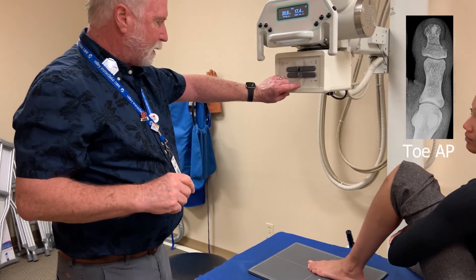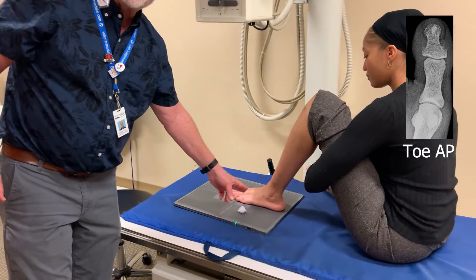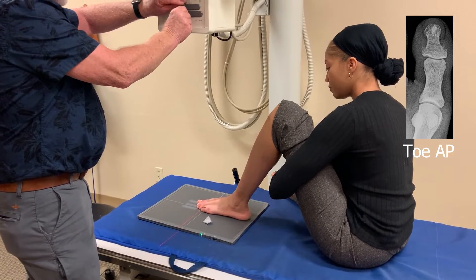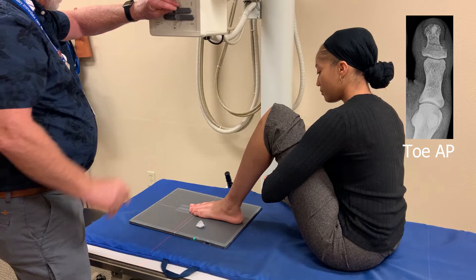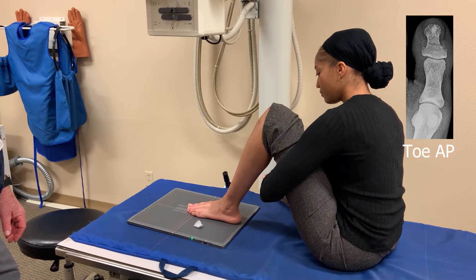AP is pretty straightforward. We typically don't angle like we do on a foot because we're not interested in the joint spaces up in the tarsal area. We're just interested in the interphalangeal joint spaces of the toe, and we center on the affected toe. In this case, we're centering on the second toe there next to the great toe. So that's our AP.